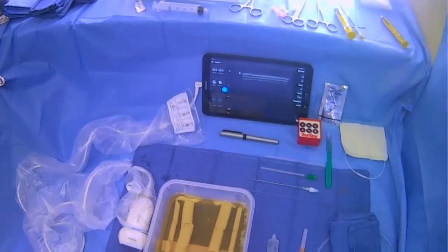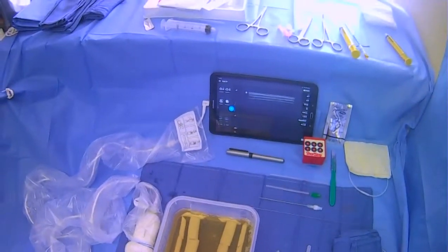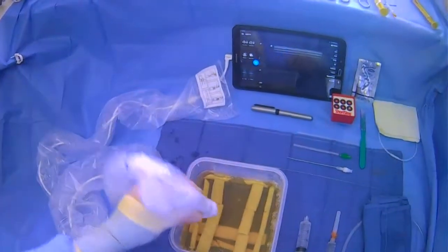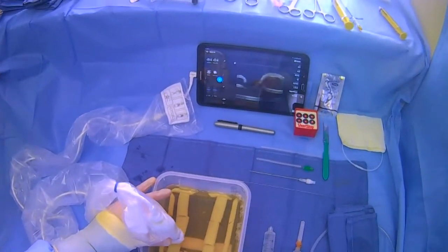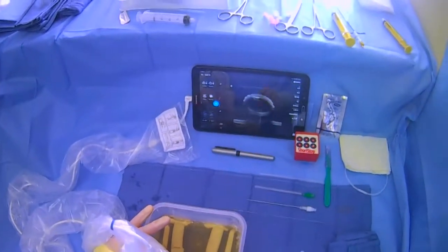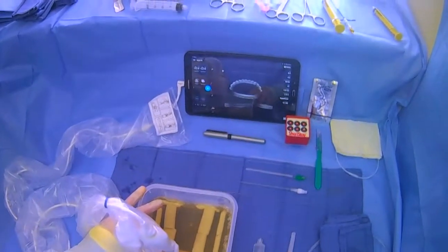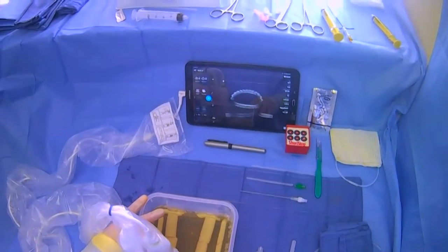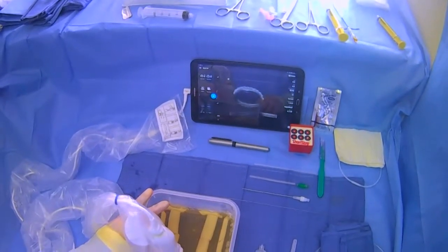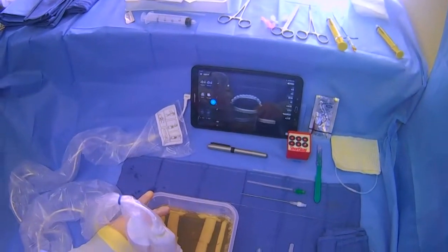We're going to go over how to do an internal jugular venous puncture — this is going to be a summary and overview, so it's going to go quickly. First, we need to scan using a high frequency linear probe placed on the neck where we expect the vessels to be. We'll see the carotid, which is the smaller pulsatile vessel, and the IJ, which is the larger, usually more lateral vessel. It should be compressible — when you push it should compress — and this is your target. Scan along the length to make sure there's no thrombus, it's not occluded, and there should not be pulsatile flow; if there is, it's an artery.